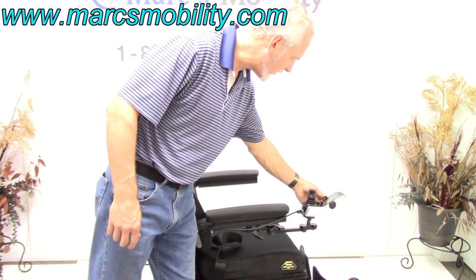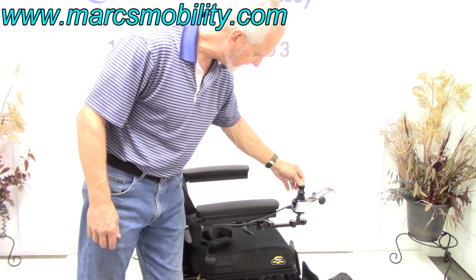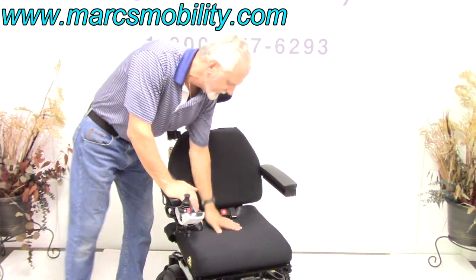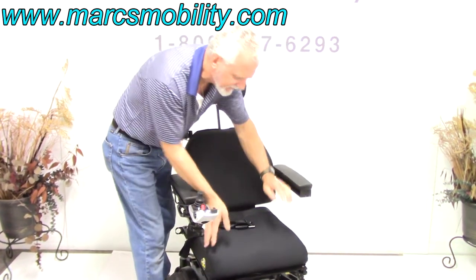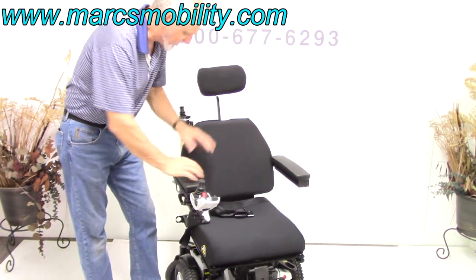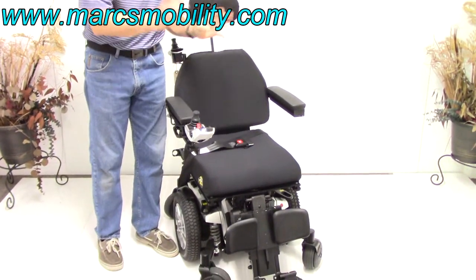When you switch it back to the front, you have to turn the power back on. The tag is still on the screen — the little scratch tag — it still tells you this chair was hardly ever used. We've got the seating system: this is a Synergy Solution cushion, very nice. You can remove this cushion and put your own if you want. This is an 18x18 cushion, so this chair was set up for a medium to small size person — 18x18 with a low back, adjustable arms, and a safety belt. If the seat is too small or too big, let us know and we can modify these seats a little bit for you.